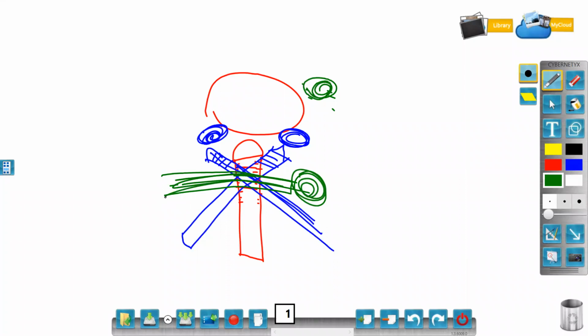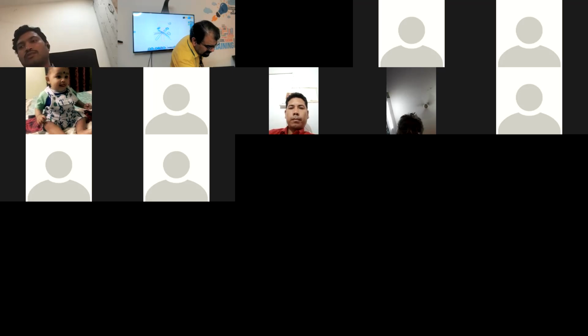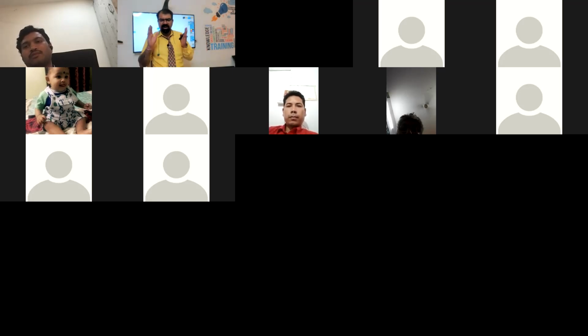Now, how can I say where the ovary is? So the point is, before taking a TVS, take a transabdominal scan. Whenever you are taking a transabdominal scan, it will give you an idea of the location of the ovary. And if the ovary is down inferior, I mean in the cul-de-sac, then you have to go to the cul-de-sac when you are inserting the probe. So don't expect the ovary to be at a fixed right or left, at 30 degrees or 40 degrees away from here or there.